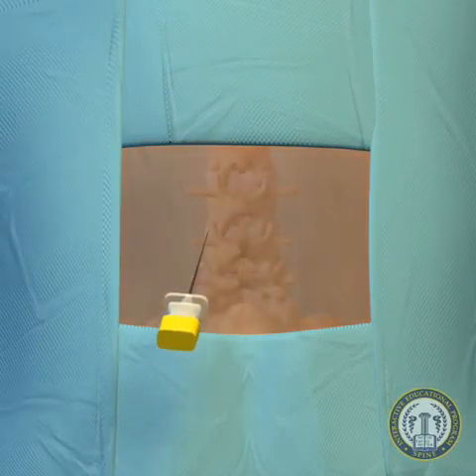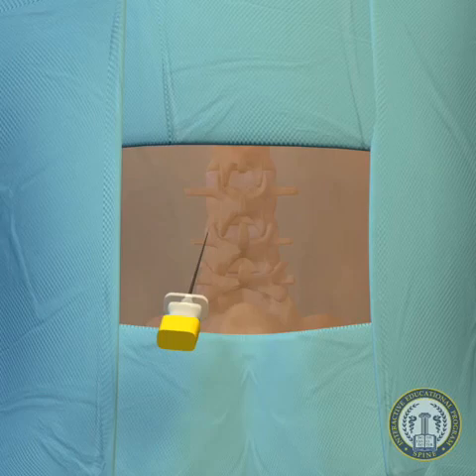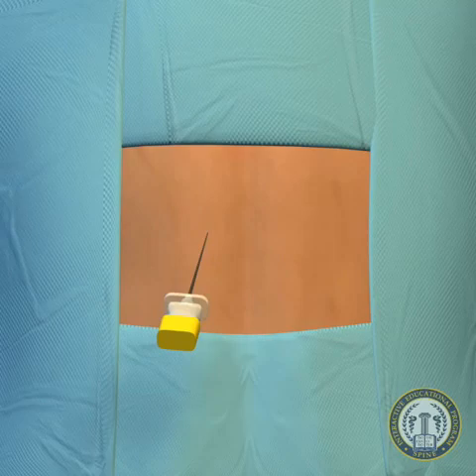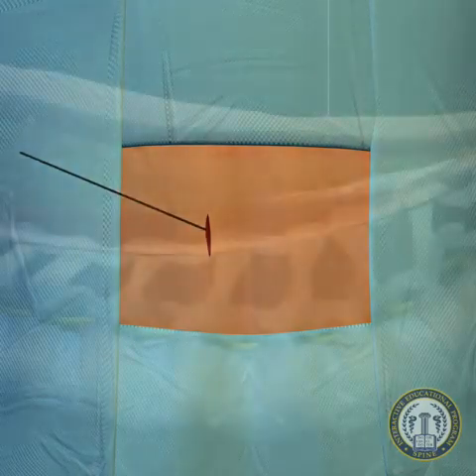After the patient is draped, a 22-gauge spinal needle is inserted into the skin directly over the ipsilateral disc space of interest. The needle is used to identify the trajectories of the screw placement and to ensure an accurate extent of the incision. For a single-level procedure, a 2.5 centimeter skin incision is centered over this point. A K-wire is directed using fluoroscopic guidance toward the facet complex with a lateral to medial trajectory.